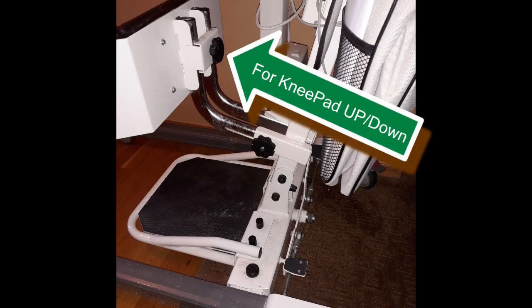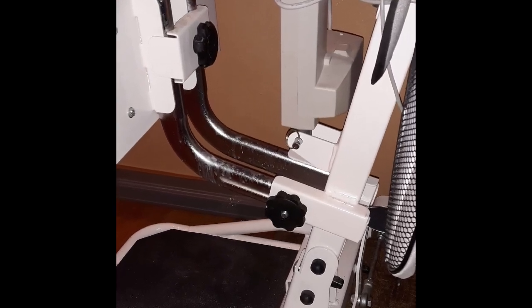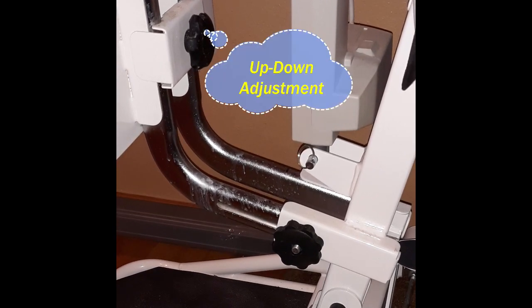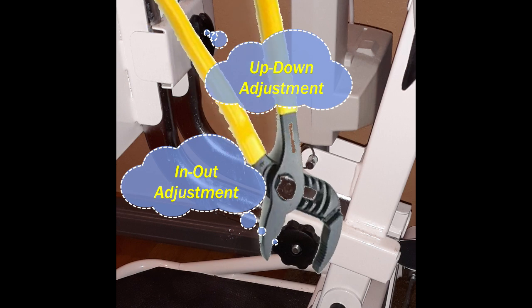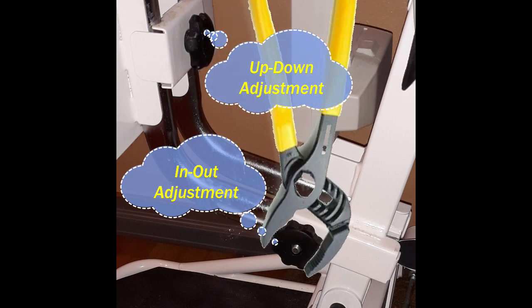Next, loosen the hardware securing the knee pad to the lift and adjust the knee pad up or down until it is slightly below the middle of the knee. Tighten the 2 securement knobs to hold the knee pad in place. As this lift will probably be used for only one patient, the IBMer, additional tightening of the adjustment knobs can be made with the large pliers to assure everything stays in position for a long period of time.